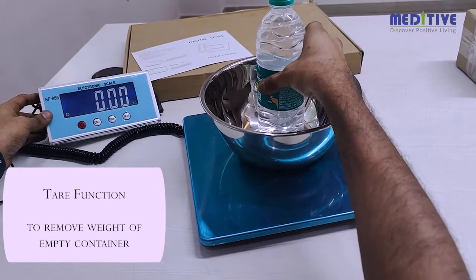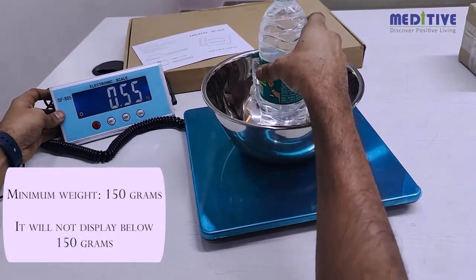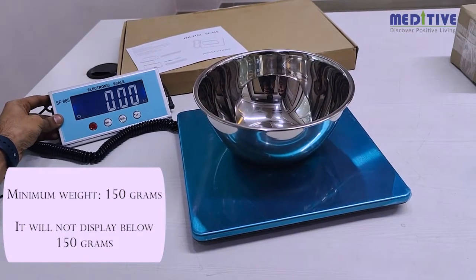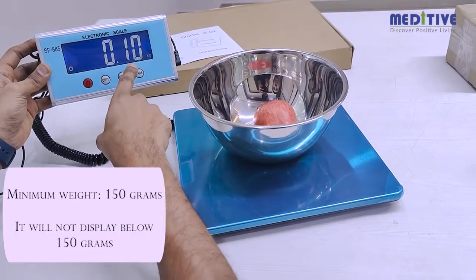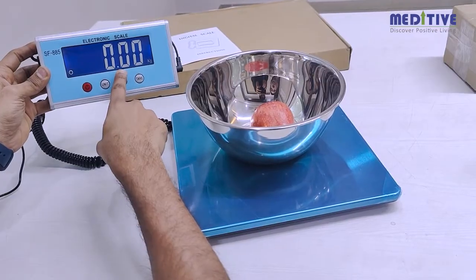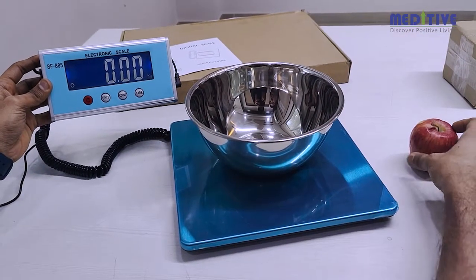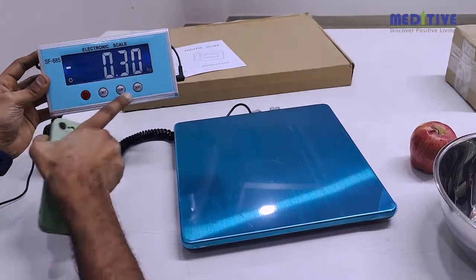Please note that this scale is not suitable for objects weighing less than 150 grams — it will not display below 150 grams. Also, the scale moves in graduations of 50 grams, meaning it cannot detect small changes in weight less than 50 grams.